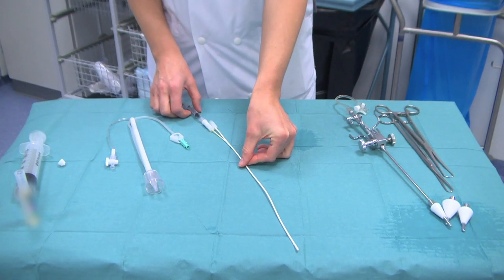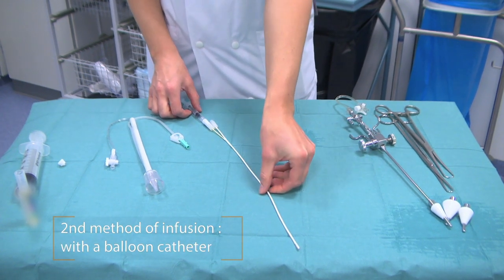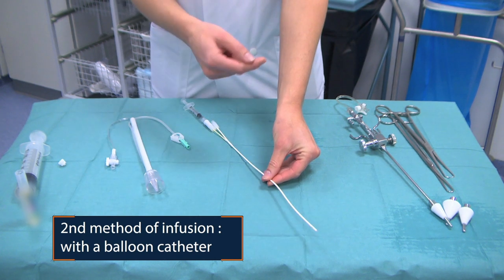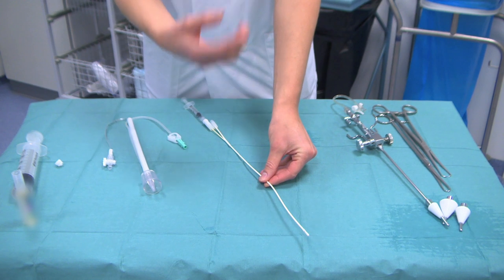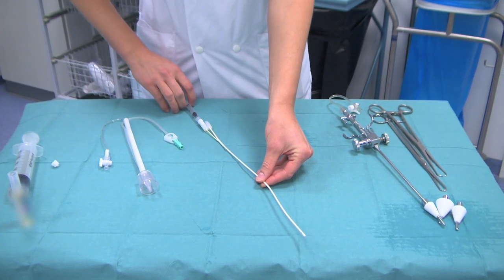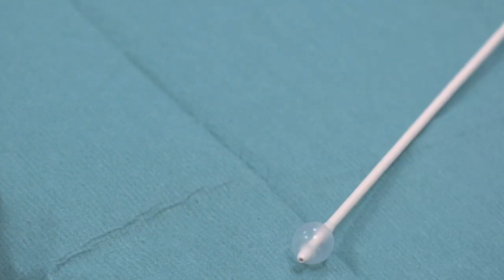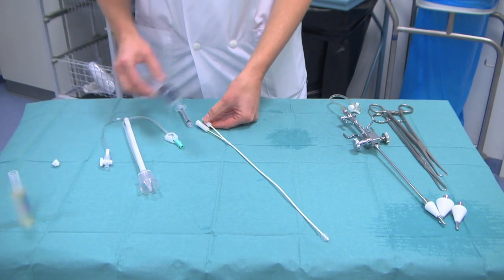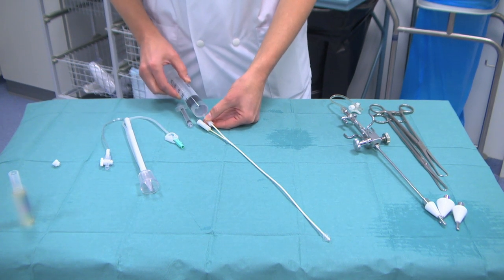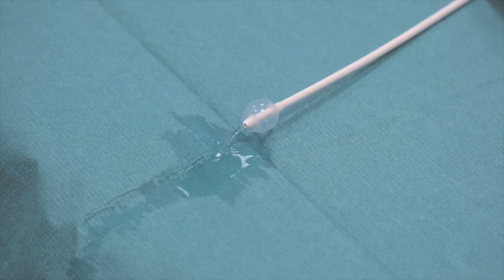A second method of infusing the contrast media into the uterus is the balloon catheter. This catheter you put into the cervix or the lower part of the uterus. To fixate the catheter, you will inflate the balloon at the tip of the catheter so it will stay inside. You will disconnect this one, and then through the other port you can inflate the contrast media into the uterus.